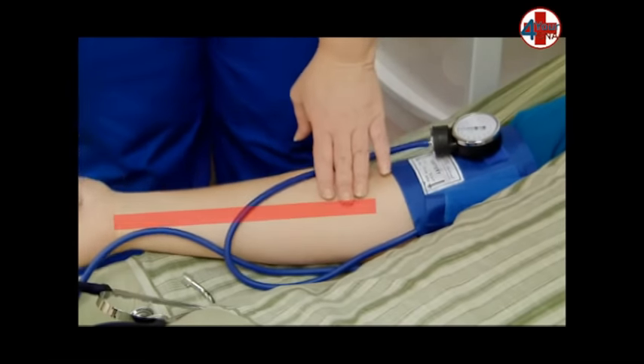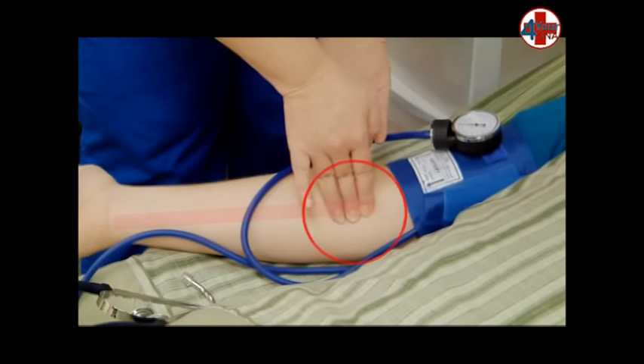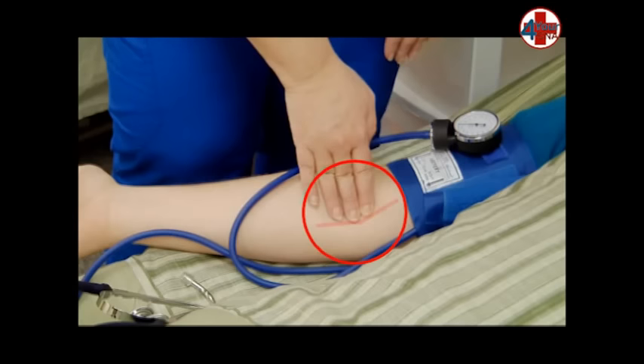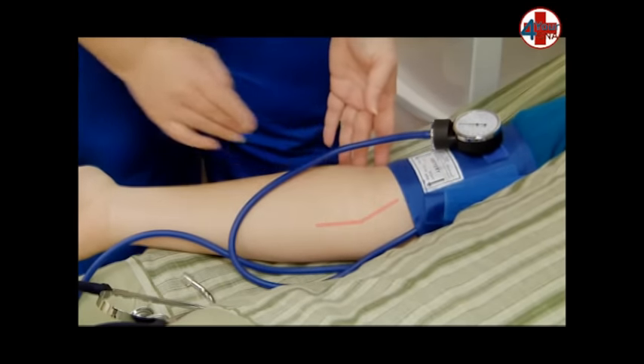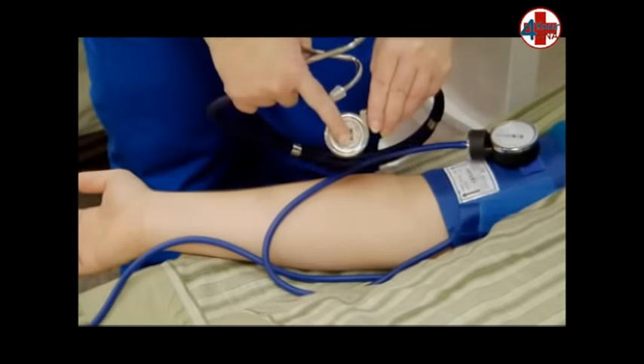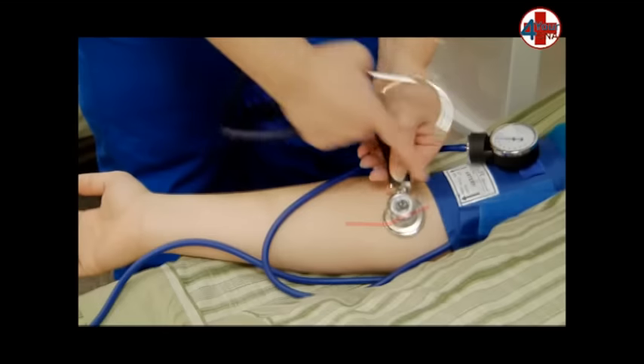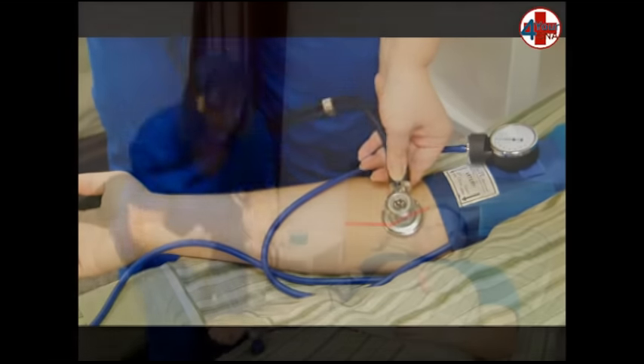The brachial artery is best felt at the fold of the elbow on the pinky side. Using your first two fingers, wiggle your fingers into the fold of the elbow on the pinky side to locate the brachial artery. The larger diaphragm on the head of the stethoscope will be placed over this artery. The arrow on the cuff should be pointed to where you felt the artery.